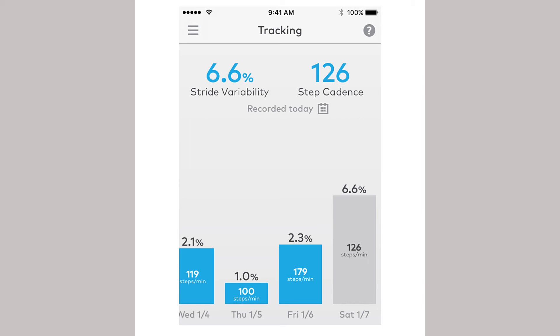Gait data will not appear until you have been walking consistently for a long enough period of time to determine the cadence and variability.